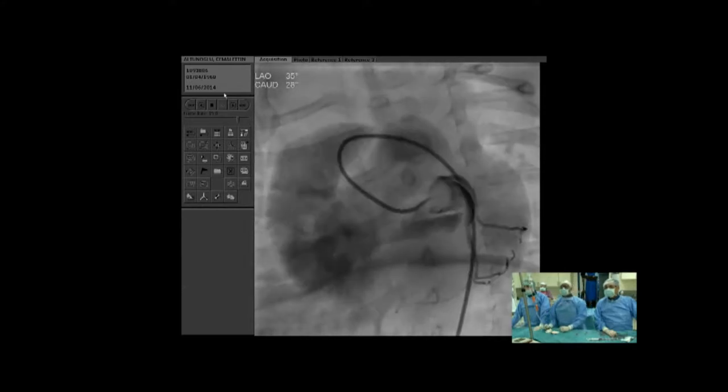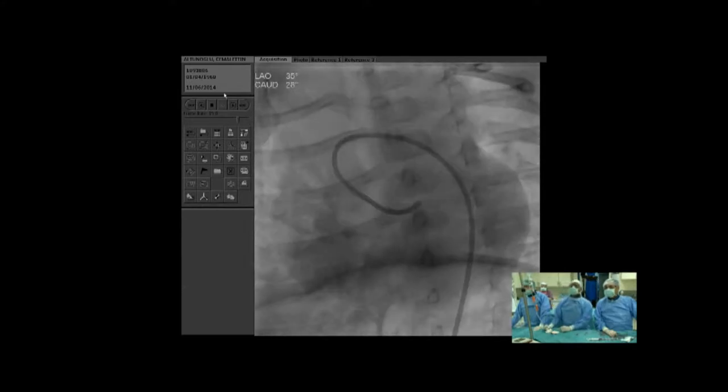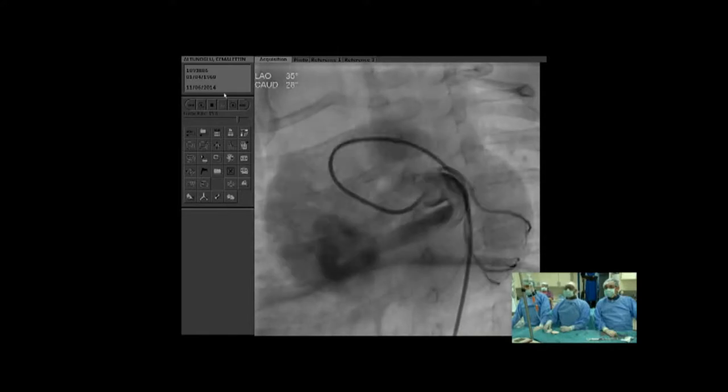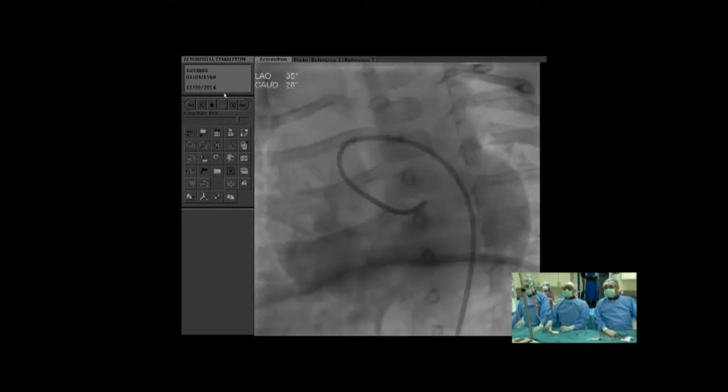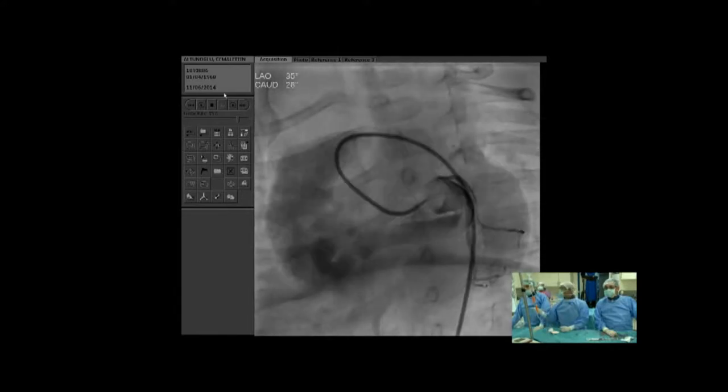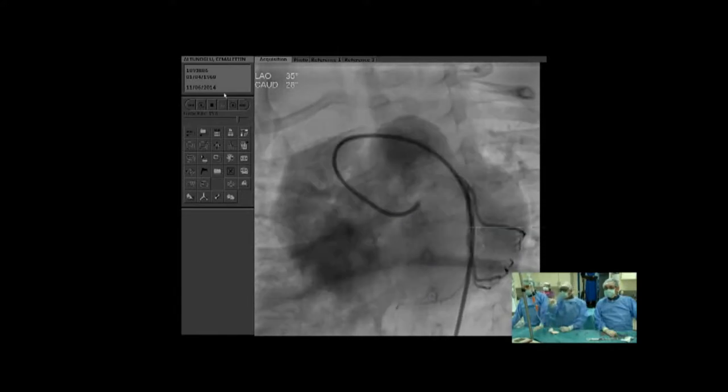We don't get a really good view of the LAD. I think the LAD is there on this projection.